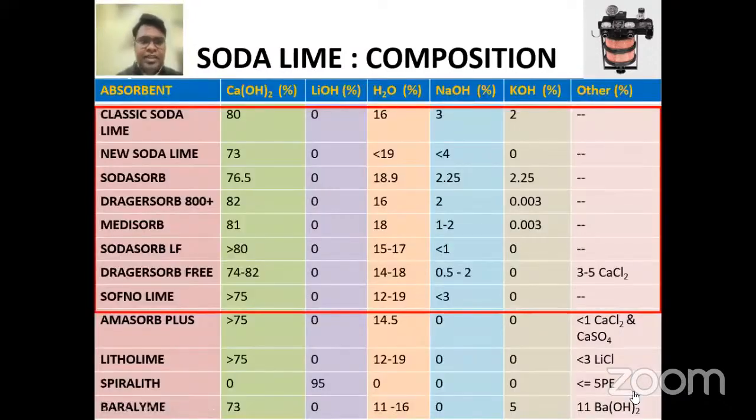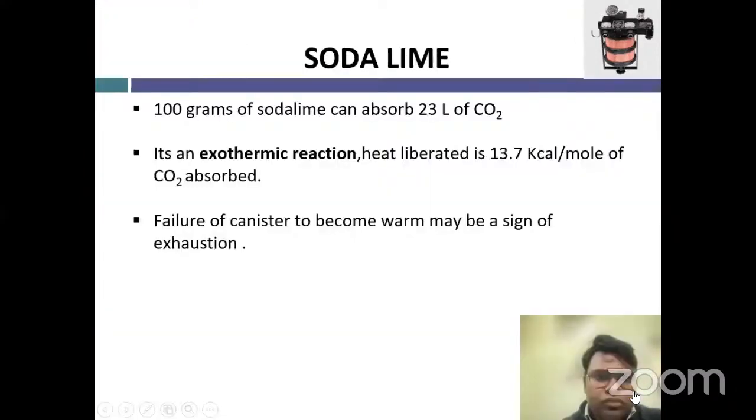Indicators are used in both classic soda lime and new soda lime. This table depicts various other forms of soda lime. CO2 absorption by soda lime generates heat, hence failure of the canister to become warm may be used as a sign of exhaustion.